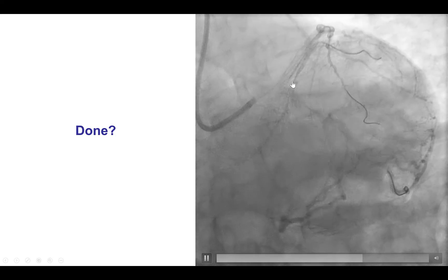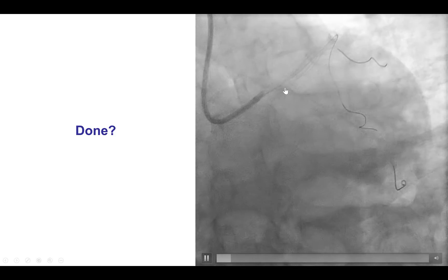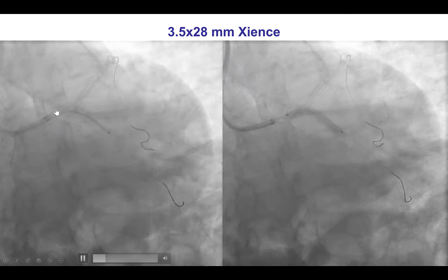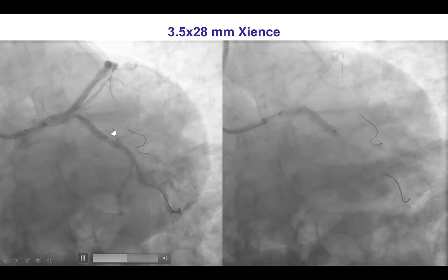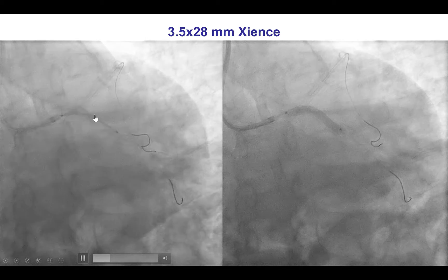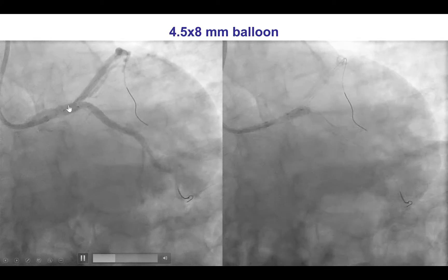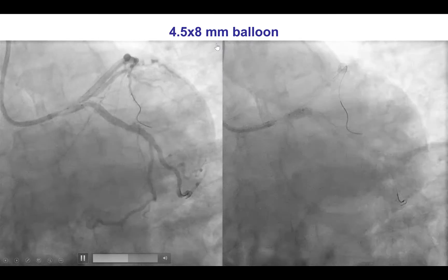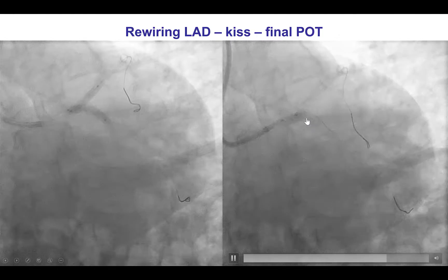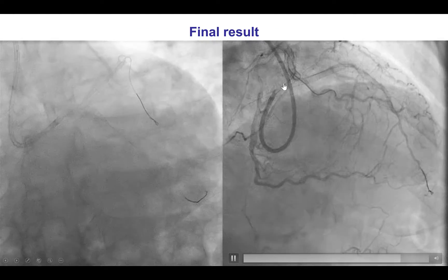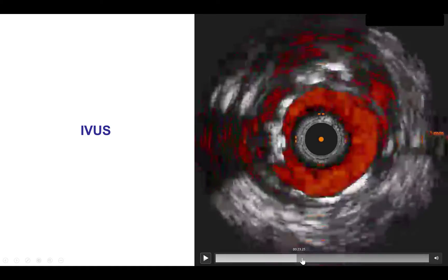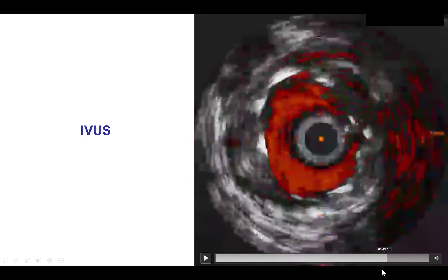The question was whether we were done. The ostium of the circumflex appeared suboptimal — there may have been plaque shift or possible dissection. We decided to treat the proximal circumflex using the provisional technique by placing a stent from the circumflex all the way into the left main, extending at least 8 millimeters into the left main to perform the proximal optimization technique. The stent was deployed, POT was performed with a 4.5 by 8 millimeter balloon, the LAD was rewired, kissing balloon inflation was performed, followed by a final proximal optimization technique — achieving a nice result in both the LAD and circumflex. This was confirmed by intravascular ultrasound in both vessels, demonstrating good stent expansion and stent apposition all the way into the left main.